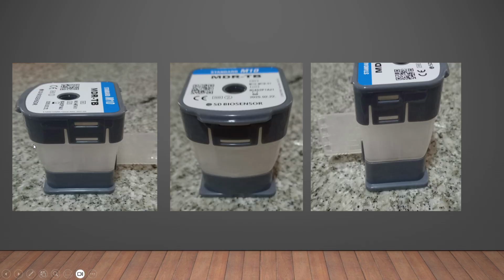Once you compress, as you can see, the whole top is sitting on that particular line. Check all the 360 degrees and make sure that at every place this is properly pressed. Now once it is pressed, the cartridge should not be tilted or moved very fast or anything of that sort, because now the individual components are all open, and the fluid can shift from one area to another. To prevent that, make sure that you don't tilt the cartridge. Once it is pressed properly, you should not tilt the cartridge at all.